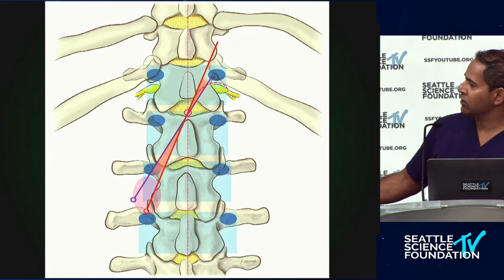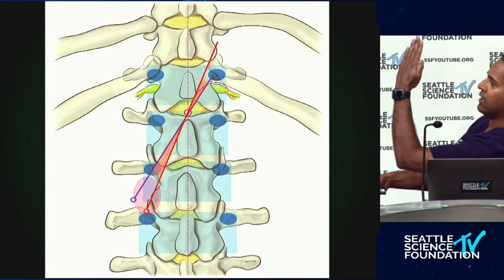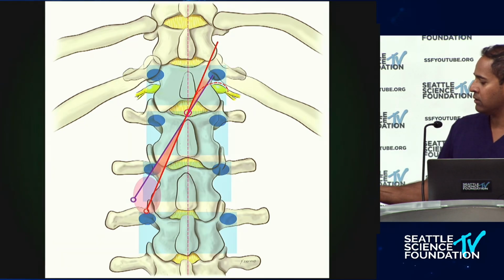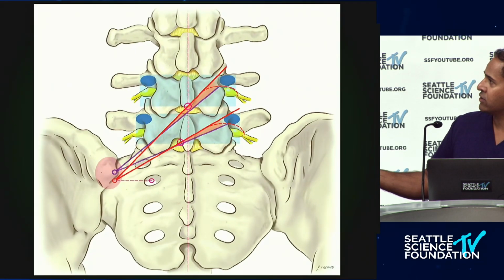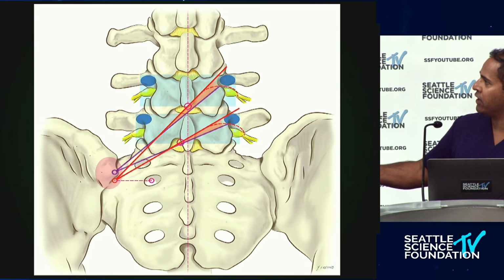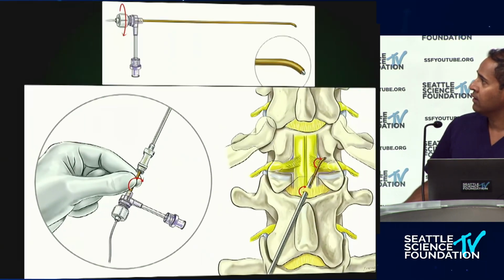And so if you're going to do L5, it's the same idea. L5 pedicle through that L5S1 intralaminar space and out. You'll notice that the angle starts to increase in laterality as you go more caudal. And that's just showing you here. So L4 and L5, you can see you're coming in at a wider angle to get to those pedicles. But it's the same concept. There's nothing different whether you're at T10 or L5. You're really just following, where is the pedicle? Where is the midpoint of my interlaminar space? Where do I want to start depending on the girth of the patient?